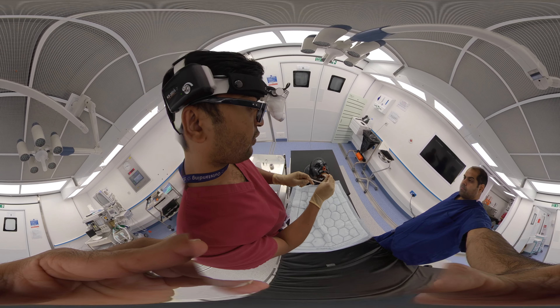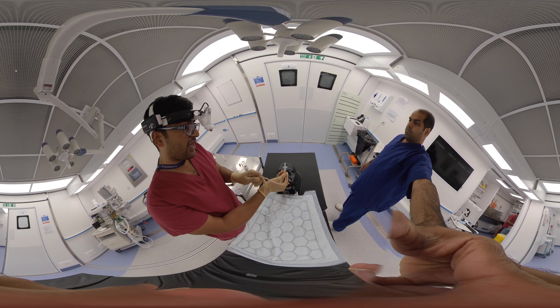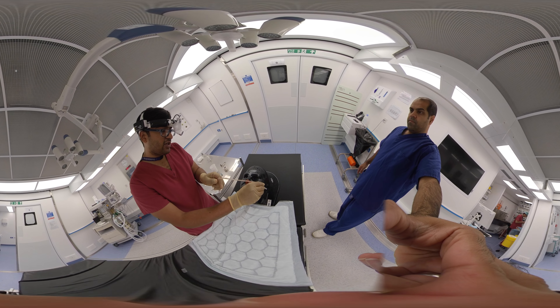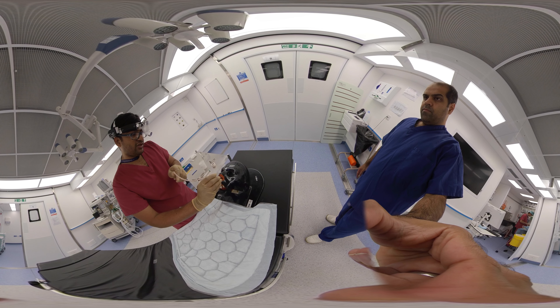We have to go along the floor of the nasal cavity. I'll demonstrate — you should not go in this direction; you have to go along the floor of the nasal cavity, like this. Now I'm going to gently introduce the Foley catheter.